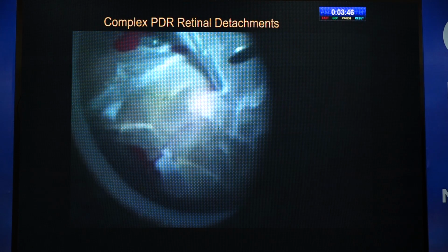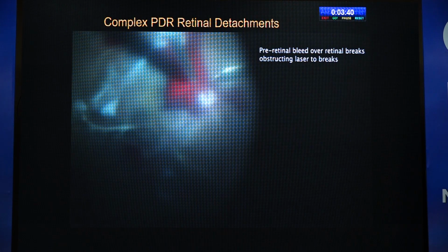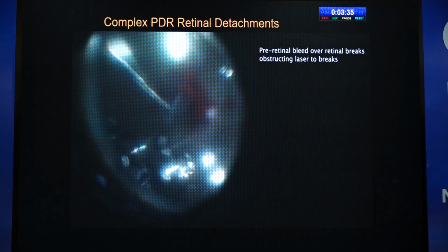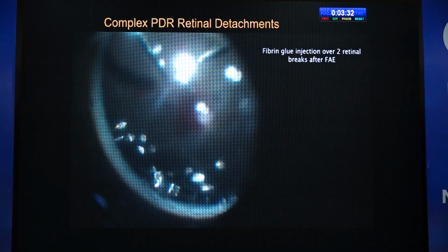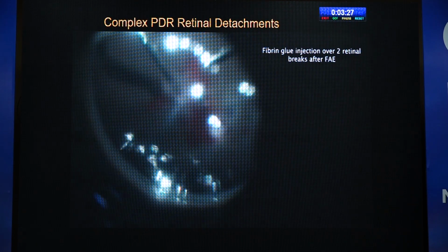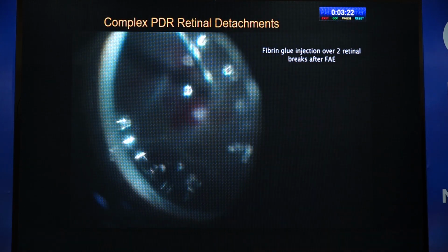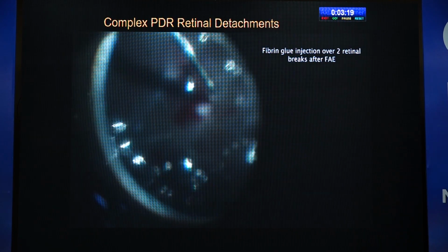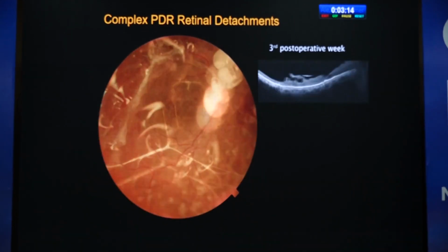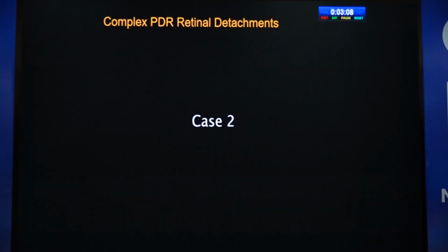As membrane peeling proceeds, it's common to have iatrogenic retinal breaks which get covered by blood. Attempts to remove this pre-retinal blood were unsuccessful. So after fluid air exchange and drying the retinal surface, these two retinal breaks were treated with the two components of fibrin glue which are injected sequentially. First, the blue top thrombin is injected, which is less viscous, and then you see these clots. These disappear by the third post-op week and the retina is attached and the glue is not visualized.